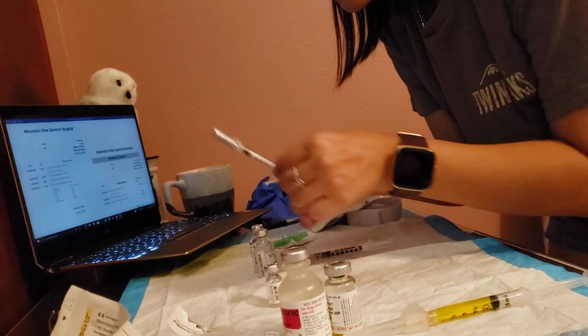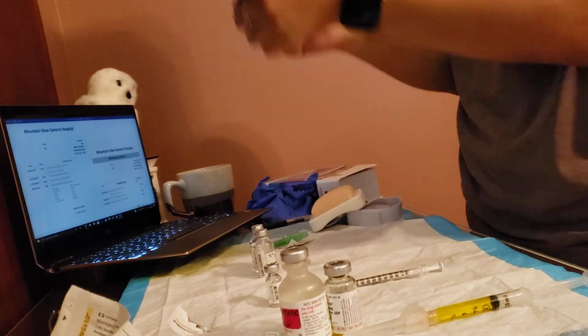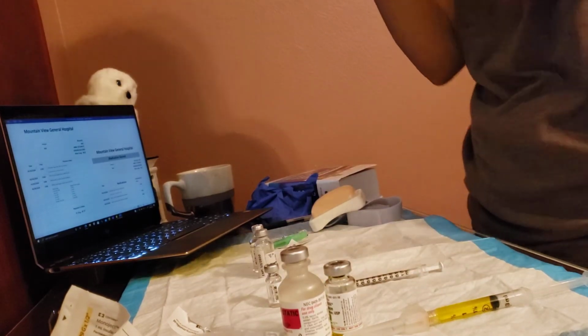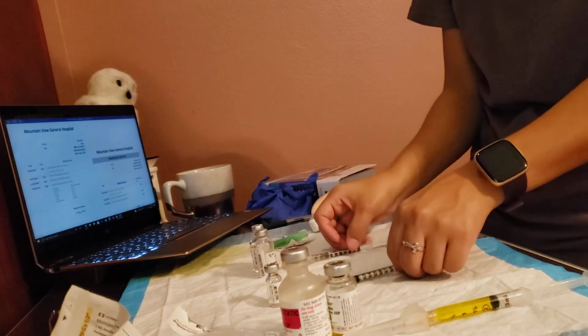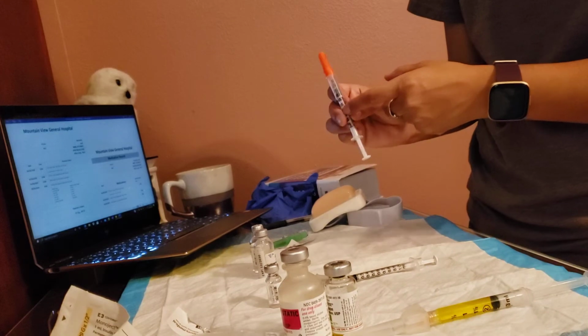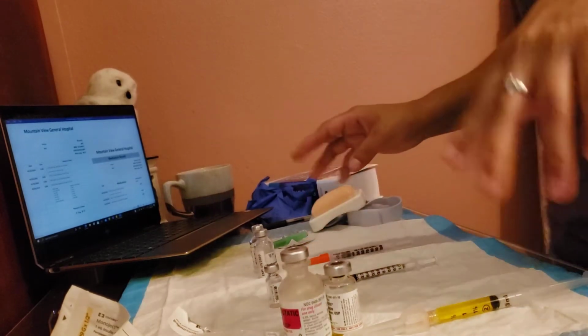And then I have 0.1 of my PPD, and I have my 24 of my insulin. Okay, and all of that is correct in my orders. So I want to give my insulin within 5 minutes, because after that it wouldn't be any good.